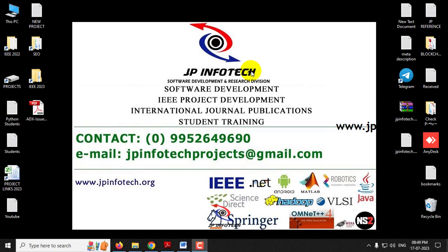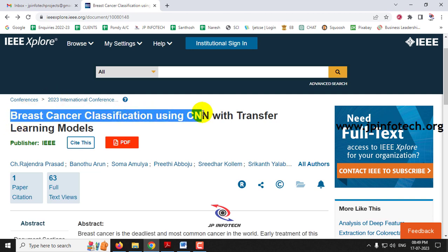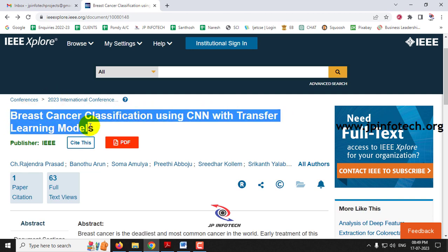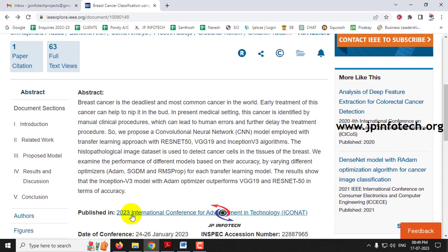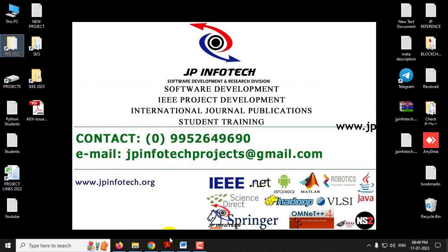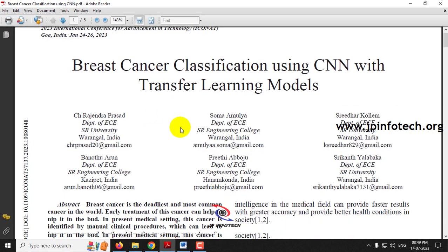Hi, in this video we are going to see about a Python project entitled Breast Cancer Classification Using CNN with Transfer Learning Models, which is an IEEE 2023 conference paper. Before seeing the execution of the project, let me brief about this project.